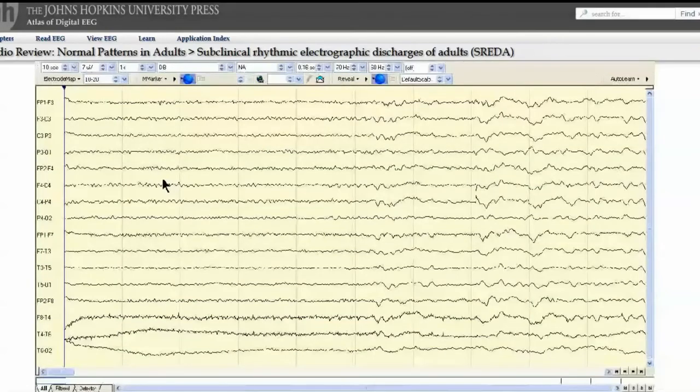This is an interesting and rare phenomenon on EEG. The patient had fallen while mowing his lawn, had a pacemaker in place, and remembered feeling faint. Nonetheless, an EEG was requested on the outside chance that he had an epileptic disturbance. The EEG here shows absence of alpha background activity, most of the activity lying in the beta range, and the absence of eye blinks. This inferentially tells us that the patient is drowsy and in stage 1 sleep.